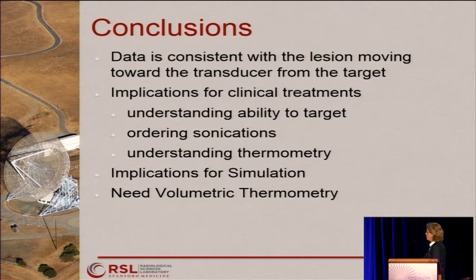you want to, how you order your sonications. Just like with fibroid treatments, for example, we probably want to go far away from the transducer and then come closer. And then also for understanding what the thermometry is telling you. Of course, there's implications for simulation. If you want to simulate the treatment and the temperature rise, you probably don't want to use the data at the end of the treatment, after this has happened.